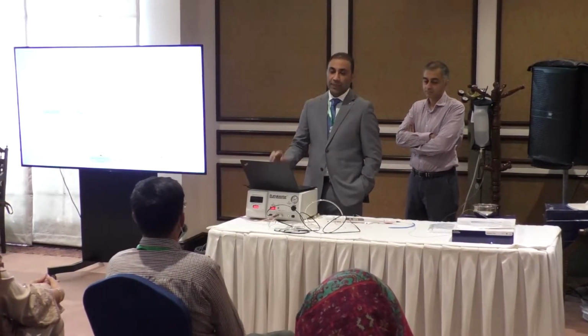If we have no IVUS facility, then what should be the angiographic criteria for atherectomy? Everything you have to decide is on angiography. With eyeballing, you can decide as we discussed. If the diameter of the vessel itself is less than 3.5, or you see diffuse calcification in at least one segment of the vessel, that definitely needs rotablation. You see a tram track appearance of the calcium. That's definitely significant calcium. Tram track means you see it in the superior and inferior wall of the vessel.